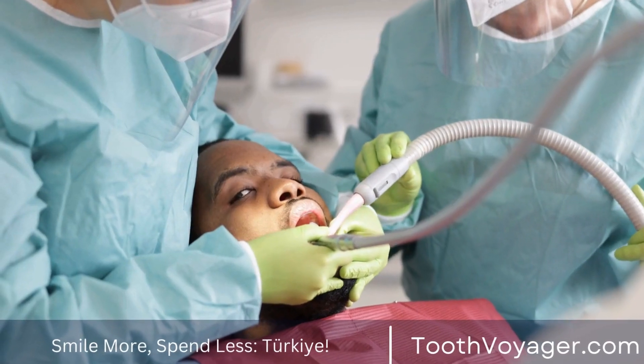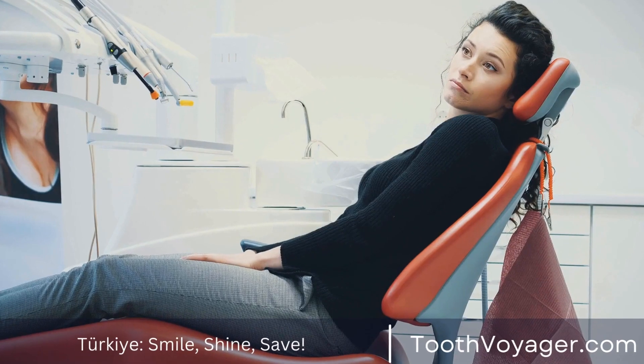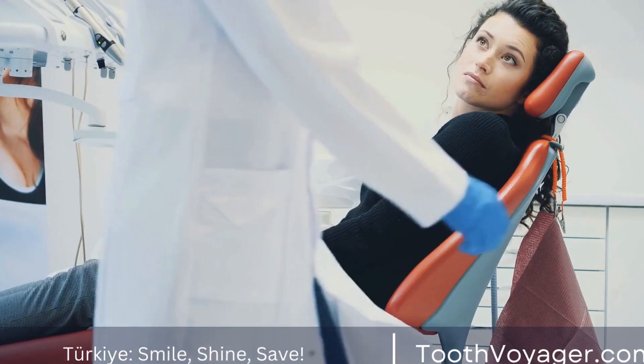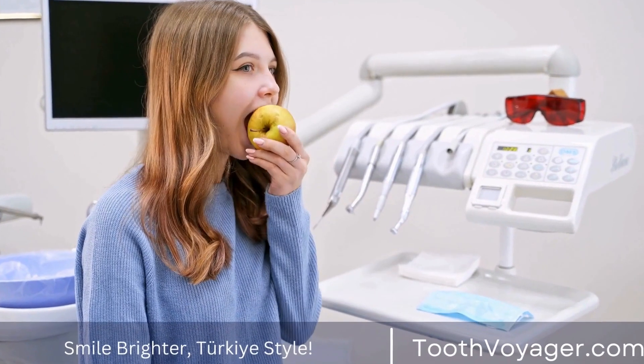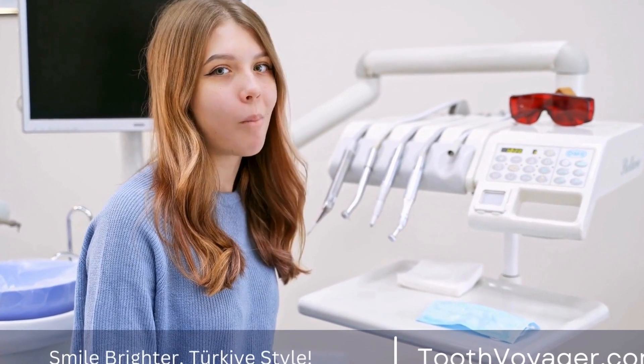The art of crafting dental crowns involves a series of steps that require precision and skill. The following are the most common techniques used in the creation of dental crowns.